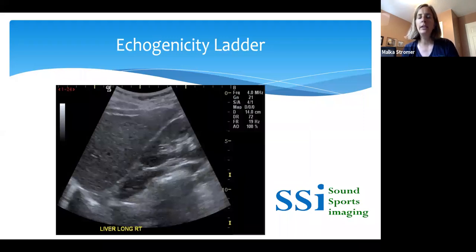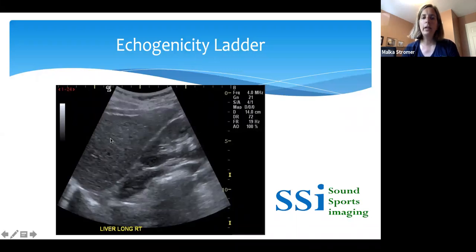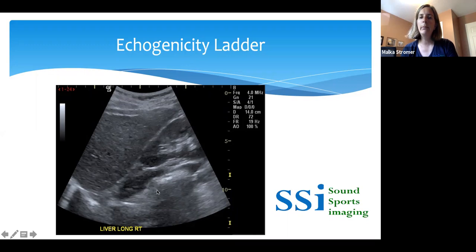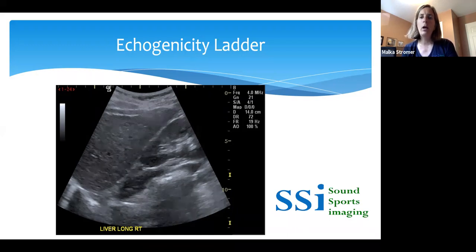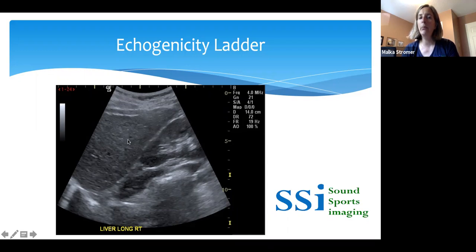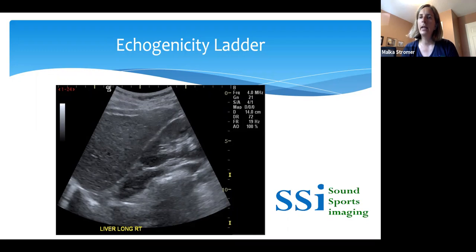It's also important to remember the echogenicity ladder and to know what normal tissue should look like. We're visualizing the liver-kidney interface, and we should see that the liver is brighter than the cortex of the kidney. The brightest echo is actually the renal sinus fat. There's a darker area posterior to the kidney — the muscle, specifically quadratus lumborum and psoas muscles. That is a correct echogenicity ladder. However, if we see the cortex of the kidney brighter than the liver, that's not normal. We need to understand the echogenicity ladder to figure that out.